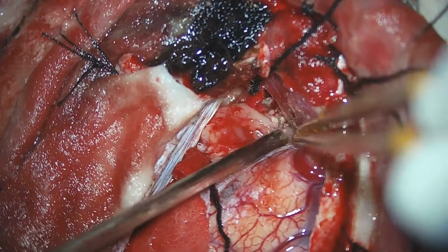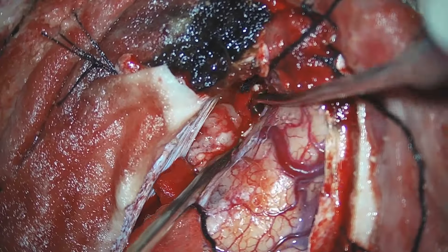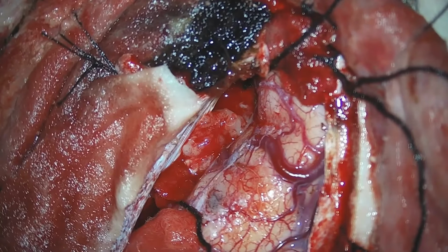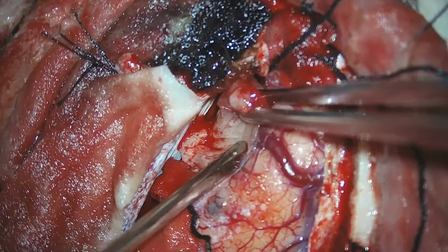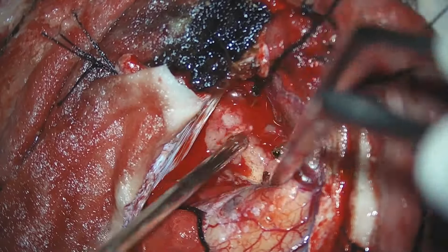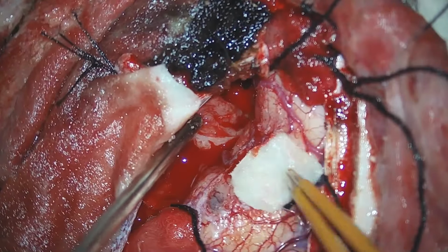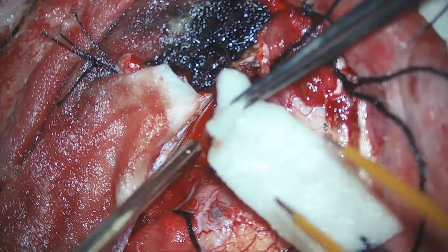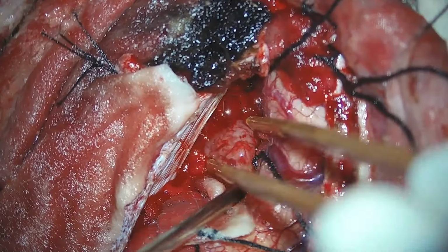The bleeding has to be controlled at every step, achieving good hemostasis so that our field always remains clear. The tumor is slowly picked up bit by bit, and we can see the normal brain area which is edematous, densely adherent to the tumor tissue. Here we cannot find any clear capsule. We slowly coagulate the tumor and remove it bit by bit. Meanwhile, we also use cotton pledgets to prevent any damage to the normal brain.